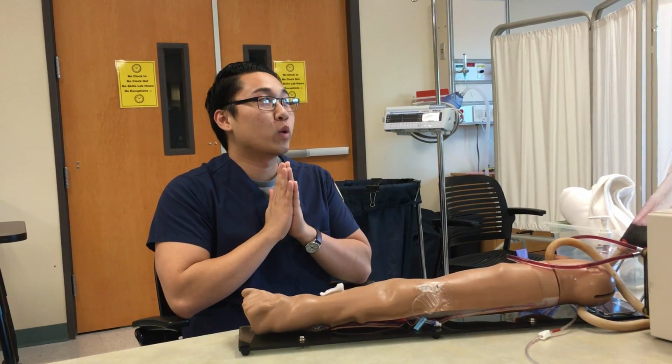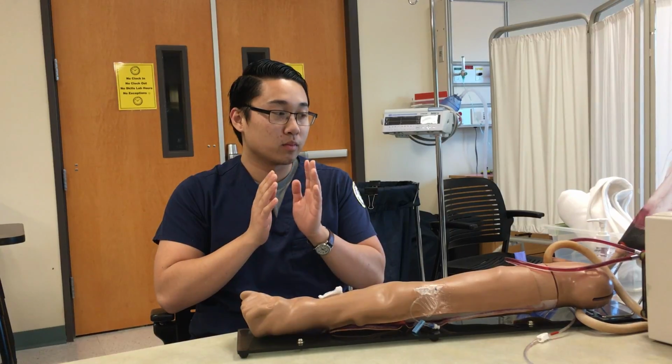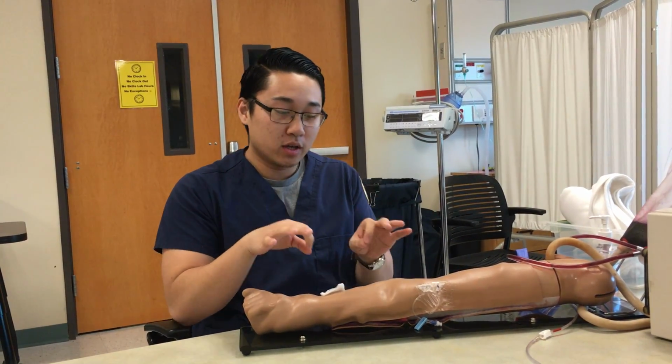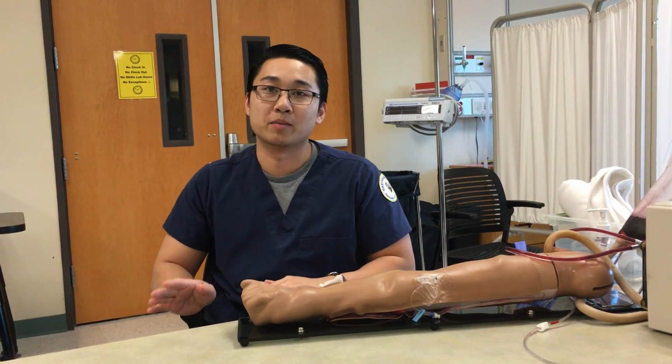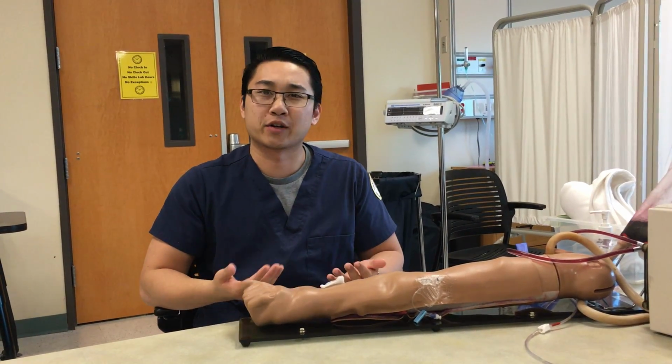And you should wait at least 30 minutes when you oxygenate a patient or give him a new device. You should wait at least 30 minutes before taking an ABG. You want to have a stable oxygenation rate before doing anything, or else it will be inaccurate.